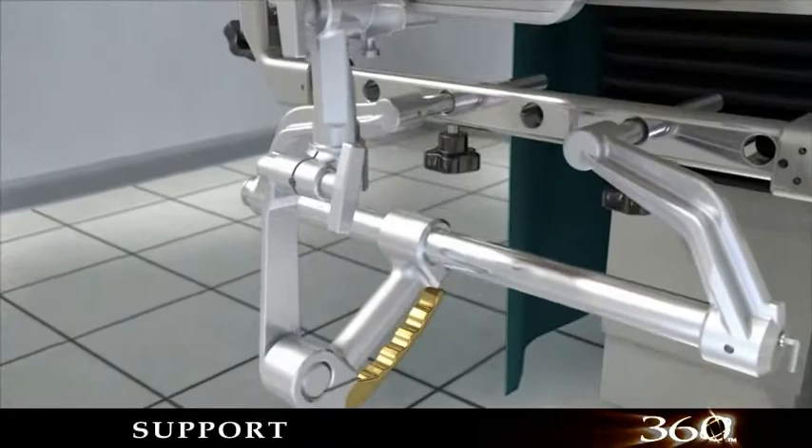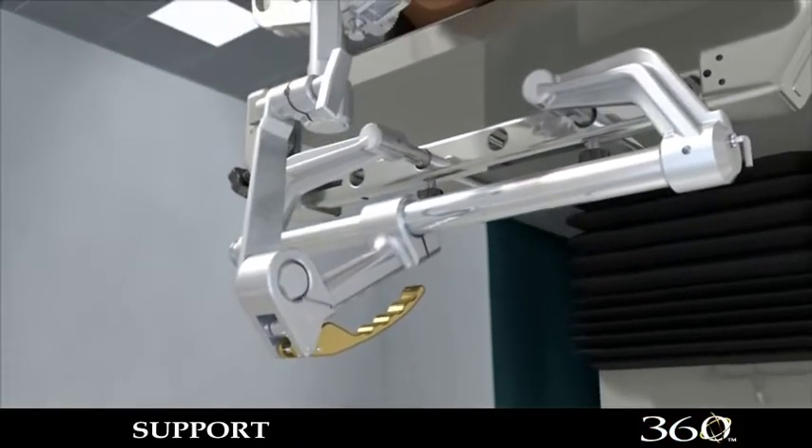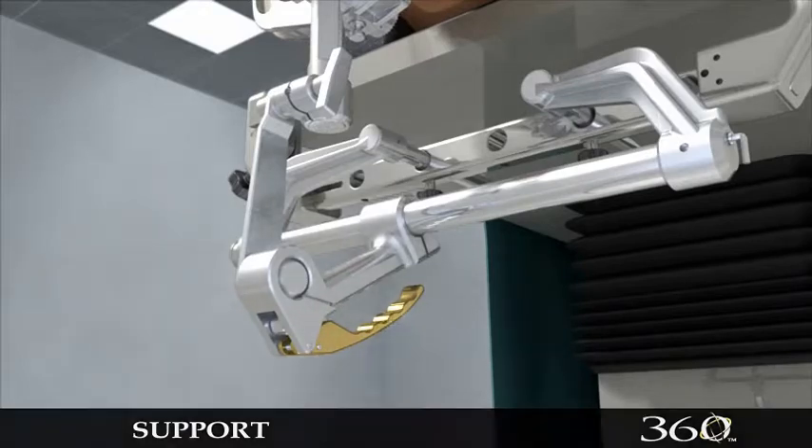The Mayfield Ultra Base Unit, introduced two years ago, provides the added support needed for image-guided surgery procedures. The distinctive gold handle assures you that you are using the best base unit available.